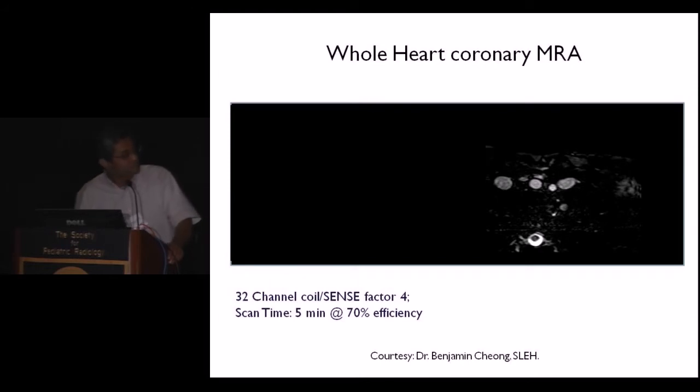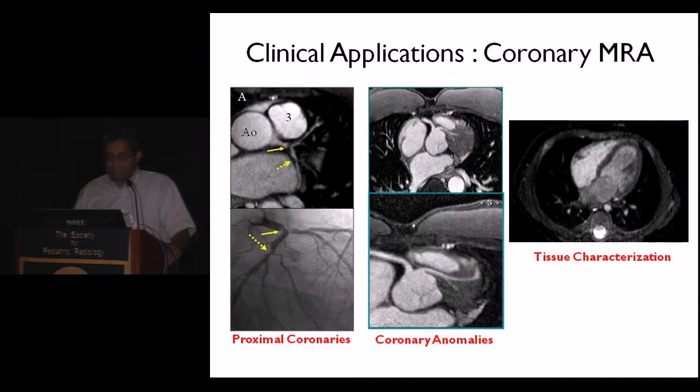One of the major problems of using navigators is that the patients might fall asleep and their breathing could be an issue. In this case, you could actually use navigator drift correction. You can set your threshold where the data will be accepted to progressively vary as acquisition time proceeds. Obviously, you could couple it with parallel imaging. So I'll skip these through. One last point, if you have a 3 Tesla scanner and if you're doing coronary MRA, the primary role is not 3D Ssfp imaging, perhaps to use 3D TFE readout so that the long TE and the long TR associated with high resolution imaging for Ssfp will be a moot point.